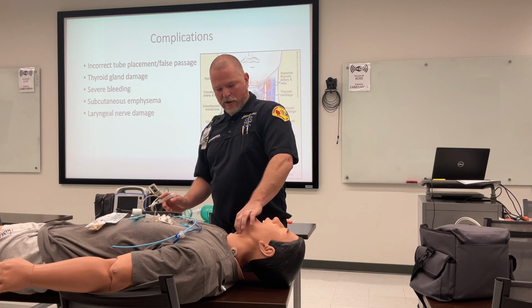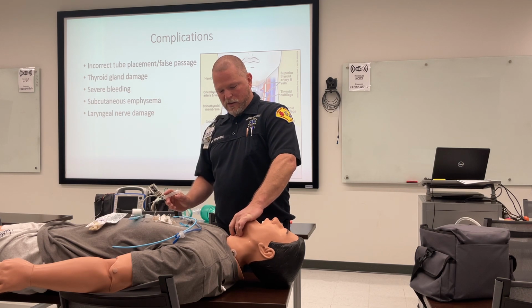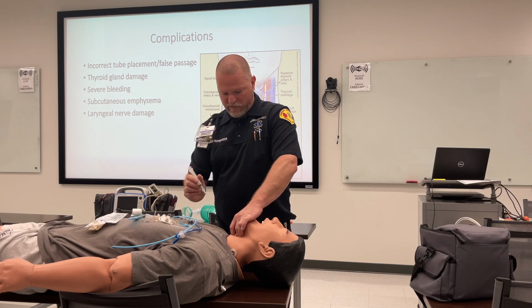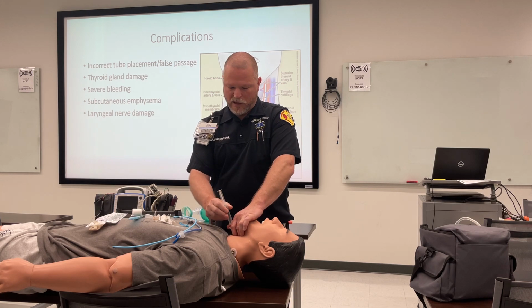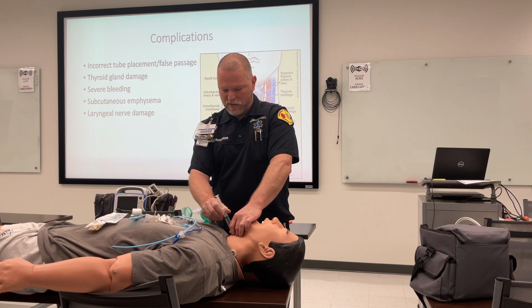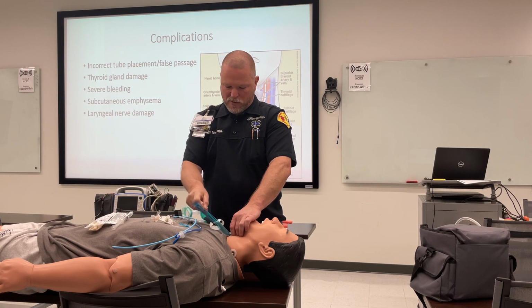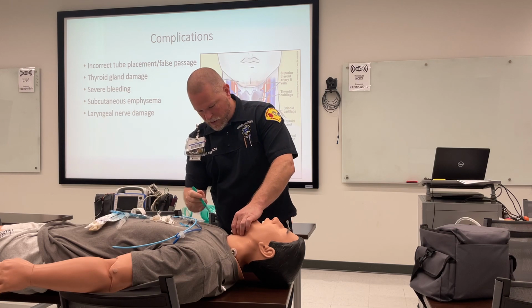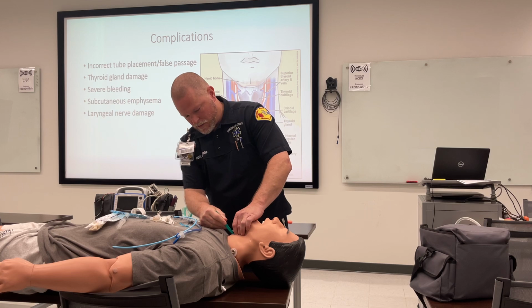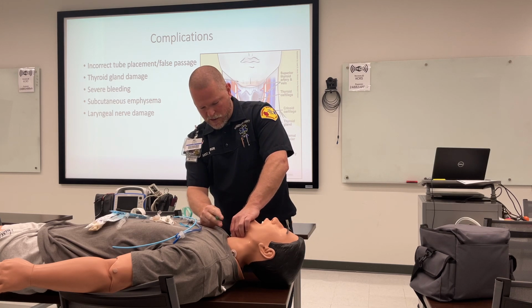We've marked our thyroid cartilage. We're holding it in that C manner. We're palpating down for the cricoid, and then the membrane in between it. When we find it, we're going to insert the needle, and as we insert the needle and get air, we know we're there. We hold still. You can actually take that off. You get your scalpel. Come in, you make your 1-inch incision above and below to where you can access the membrane.